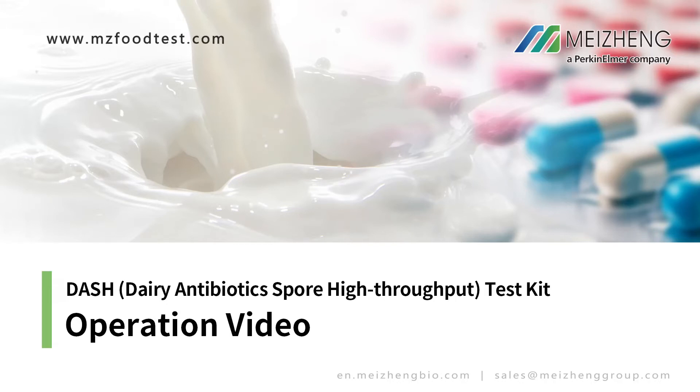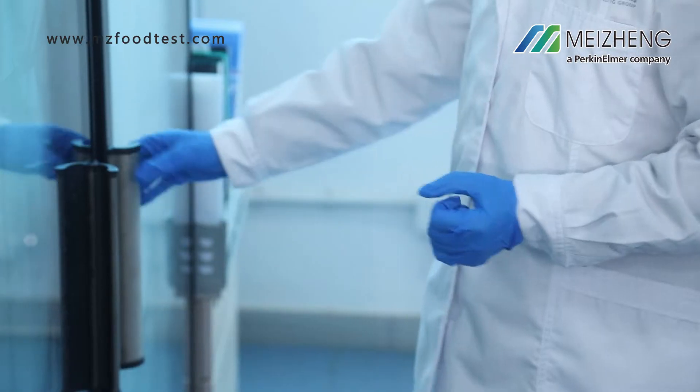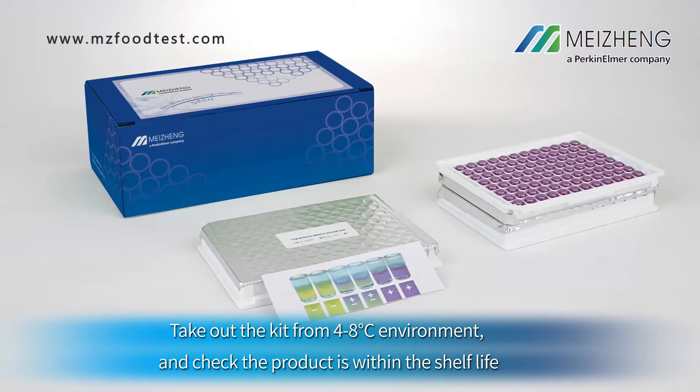Dash Test Kit Operation Video. Take out the kit from the 4 to 8 degree Celsius environment and check that the product is within its shelf life.